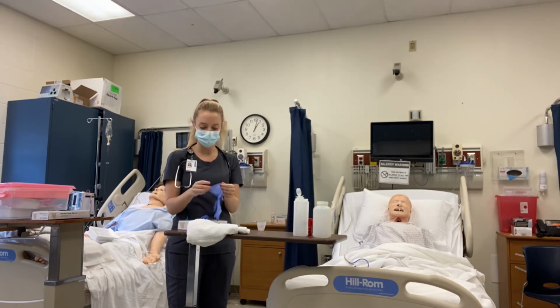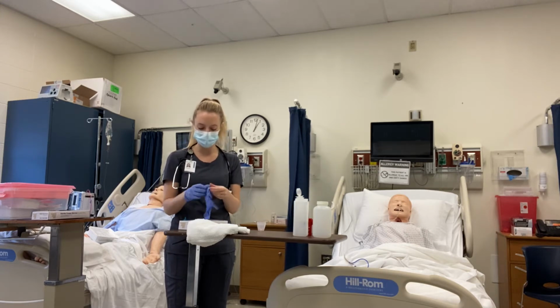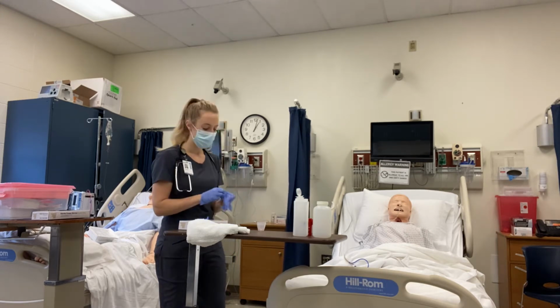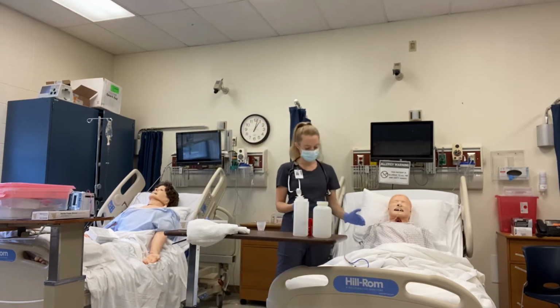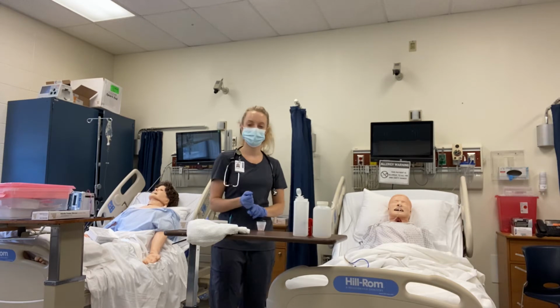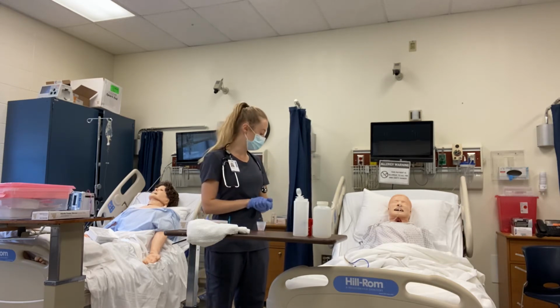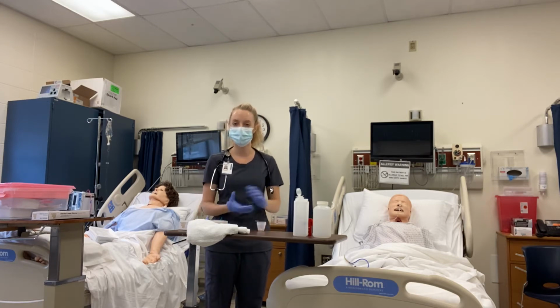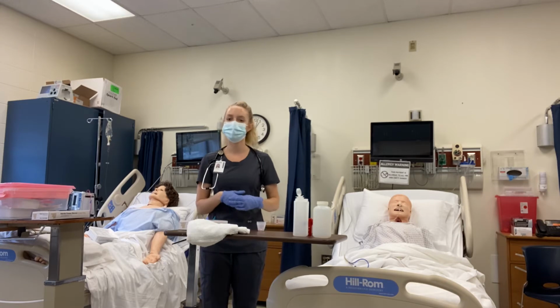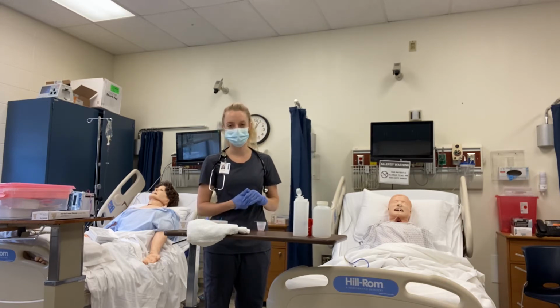My first step is to make sure that I'm administering the right medication to the right patient, the right time, the right route. Mr. Jones, could you verify your name and date of birth for me, please? Thank you. I also want to make sure that Mr. Jones has no allergies to the medication I'm administering, and that any previous assessments that should be done have been completed. If I was administering a hypertensive medication, I would want to take Mr. Jones' blood pressure, heart rate, and respirations before administering.